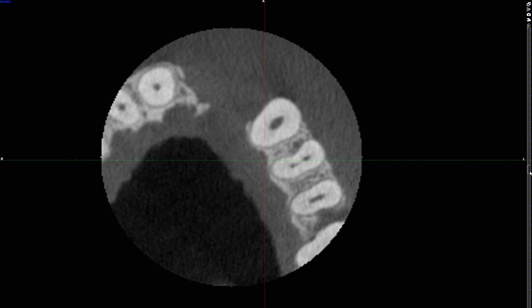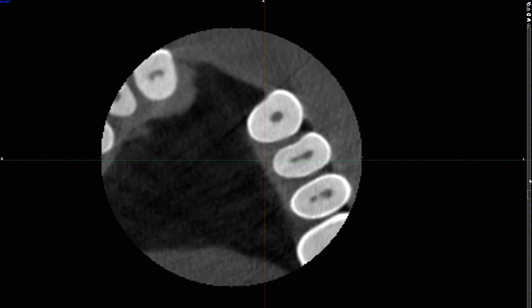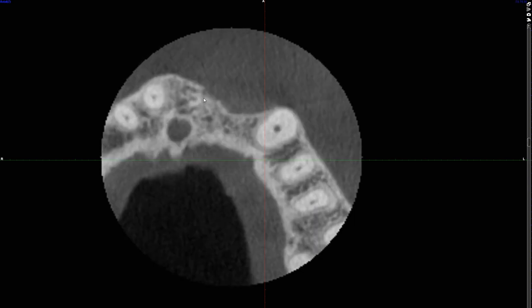Yes, this is correct. You can already see, without cross-sectional images, that the buccal-lingual or buccal-palatal dimension of the ridge is quite a bit narrower compared to the contralateral side. So that's why this was taken.